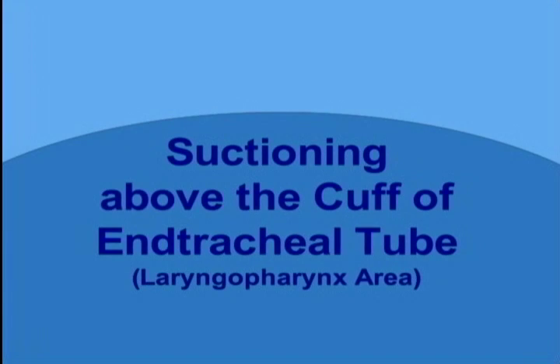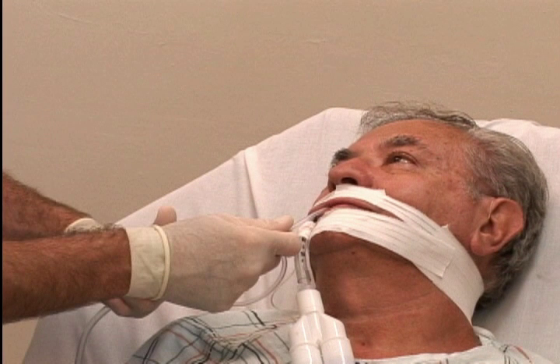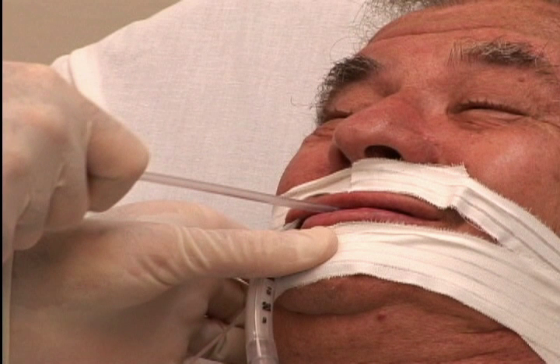Suctioning above the cuff of the endotracheal tube — laryngopharynx area. Suctioning above the cuff of the ET tube is known to decrease VAP and should be done every 4 hours before alternating ET tube position or before checking ET tube cuff pressures. The suction catheter is inserted in the mouth and continues down the back of the throat into the laryngopharynx area. Using this insertion method, the patient can easily bite down on the suction catheter, stopping the suctioning process, bite off a piece of the catheter, and the catheter has a tendency to coil in the back of the throat.